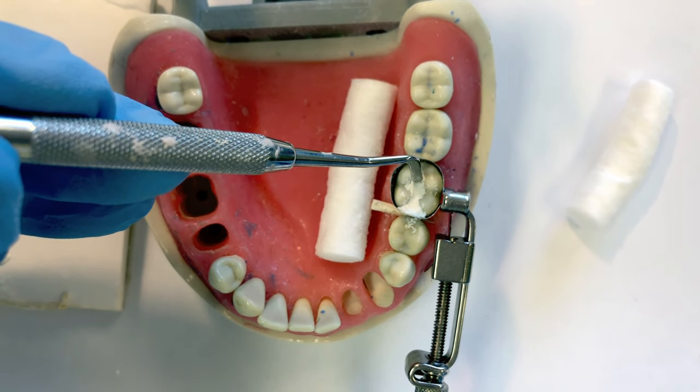Then carefully remove your band. Lift up on the side that does not have the restoration. If you have an MOD, just pick a side, but if it's not an MOD, pick up the side without the restoration first — usually that one stays in place. Take a look at your restoration before pulling the band out; make sure it doesn't stick. If you waited for the initial set you should be fine. Lift up and slide it out carefully — these bands are sharp and you don't want to lacerate the patient's soft tissue.